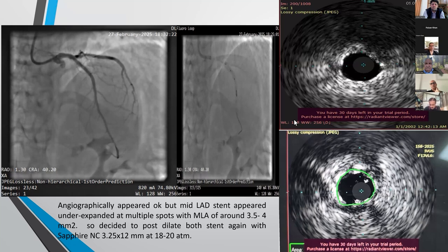I think that's a very valid concern, but cost is also a major issue. So we should, as a society, try to find a solution, if there is an option of sterilization and reuse for these. I've occasionally used reused IVUS, but I've informed the family: if you get a new catheter, this is the cost, and with reuse, there is a different cost. With IVUS, if you're using it 2-3 times, I've not seen an image problem. But it's been a very occasional thing. Typically, I just use new catheters.